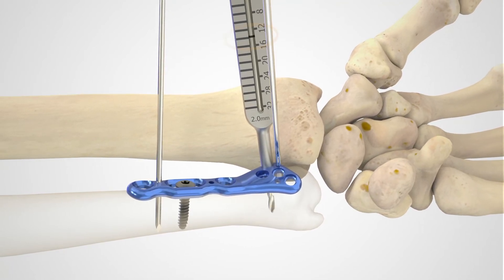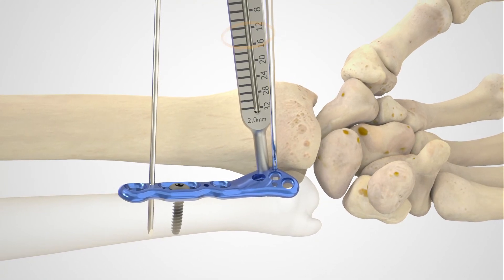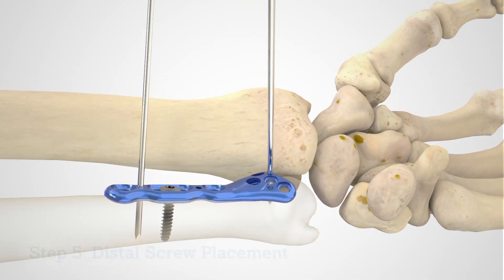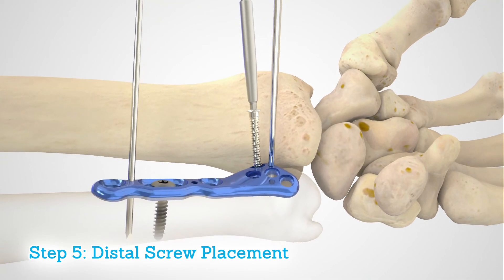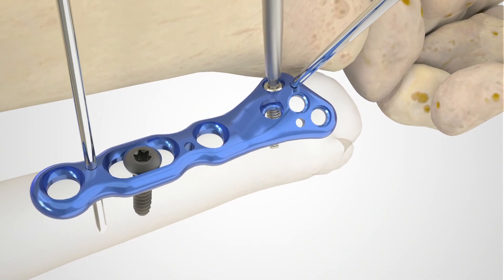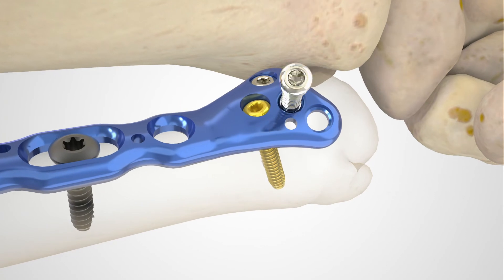Depth measurement can be determined by utilizing the laser lines on the 2.0 millimeter drill or the distal radius probe. Alternatively, the 2.3 millimeter screw depth gauge can be utilized. The distal screw holes accept 2.3 millimeter locking screws, locking pegs, and non-locking cortical screws. Insert the selected screw using the 1.5 millimeter hex driver tip and the silver cruciform driver handle.